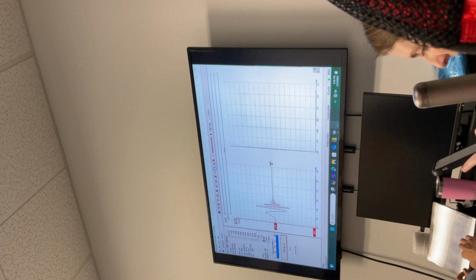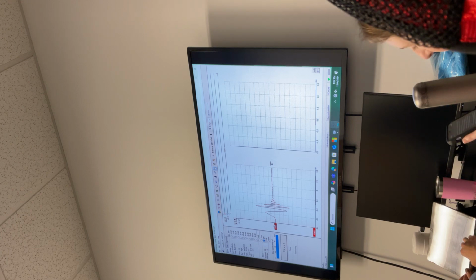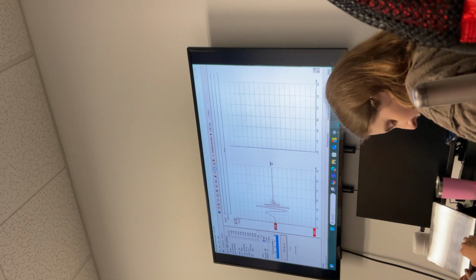Another problem is at 500 Hz, you're already seeing some 500 Hz response that appears more rounded, just going negative. It will help you to identify the peak or the negativity by having a longer time window before wave 5 and one after wave 5. But with chirp, you would see something going immediately negative. You would not see that flat line then going negative. That's why you need a little more practice looking at 500 Hz.